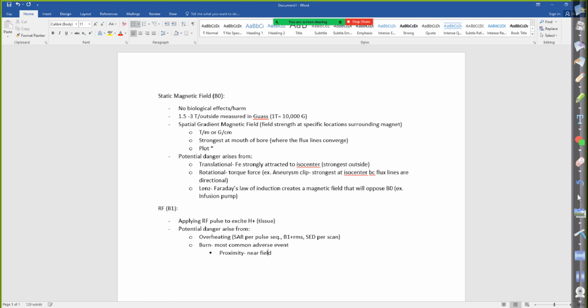So tissue in the near field touching our transmit coil. And remember, the transmit coil, really good students choose MRI, really is, remember, with that nesting doll, there really is the RF magnetic field, and that's the closest to the patient.